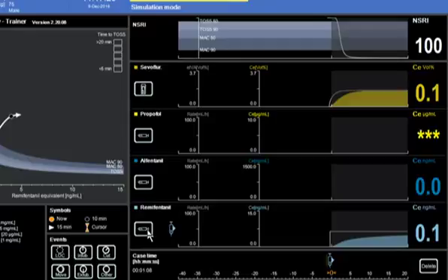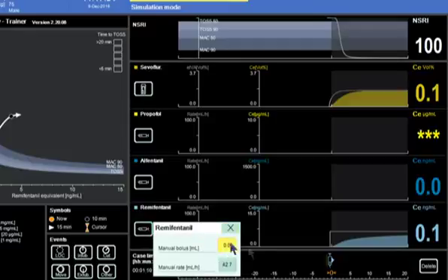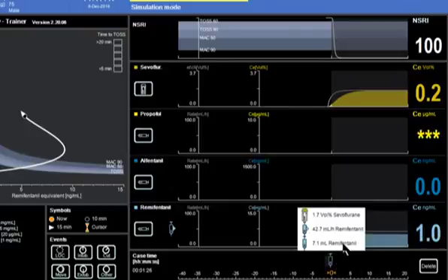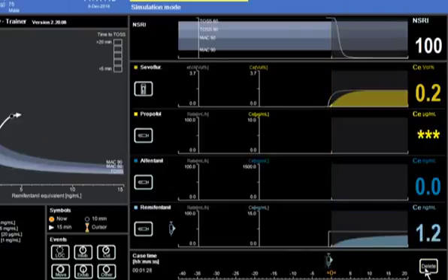And you can add any bolus you want during the case, like I can do here, and you see the effect directly on the screen, on the what-if function, and you can validate. If you just want to show and see how it will act on the patient, even before pushing the drug into the patient, you can delete it afterward and say, no, I don't want it anymore, and everything comes back. It could also be a very good teaching tool.